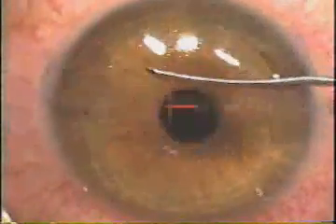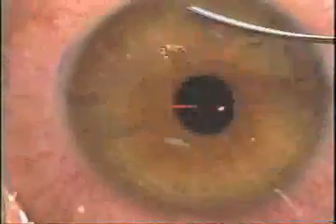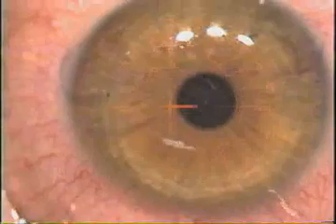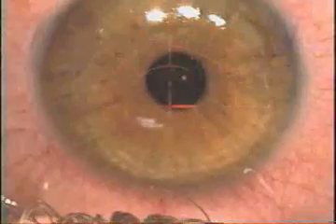And he likes to move. And I kind of gave up on telling him to hold still. So, but we've got it back down where we want it. I'm just going to check the edge and make sure that it's perfect. We see some of the oily component of that tear film now. We all have that. Now, we do a little squeegee on the edge here. You've always got to clean the windshield when you do that. So that's what we're doing there.